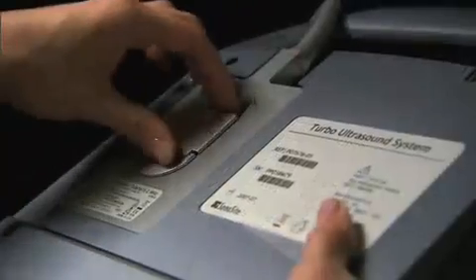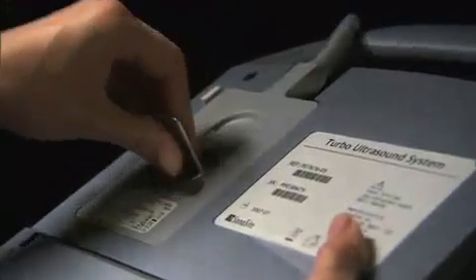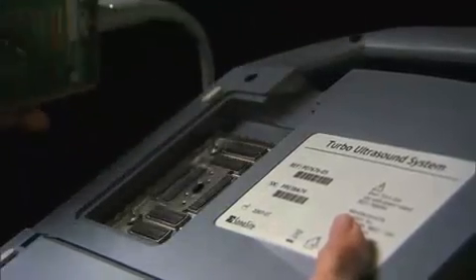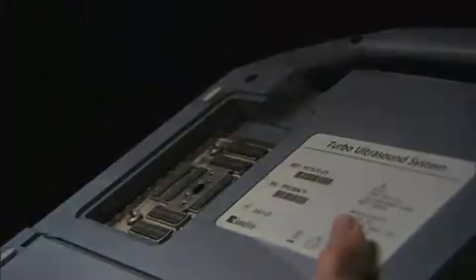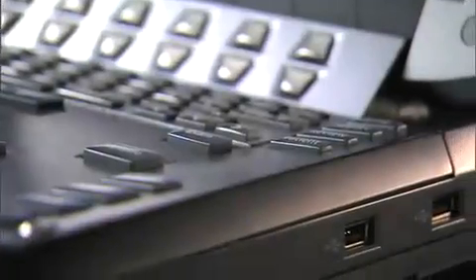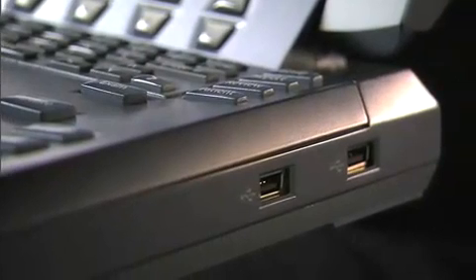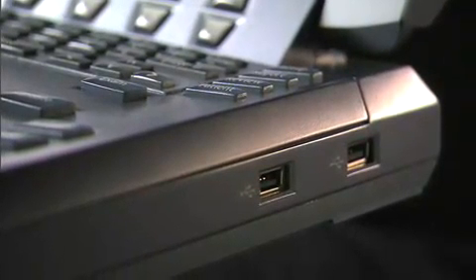To remove the transducer, pull the latch up and rotate it clockwise, then pull the transducer connector away from the system. On the right side of the system, there are ports for USB devices, which can be used for image storage and system software upgrades.